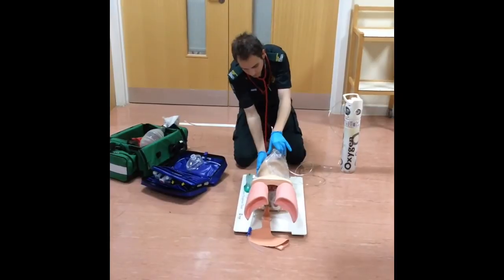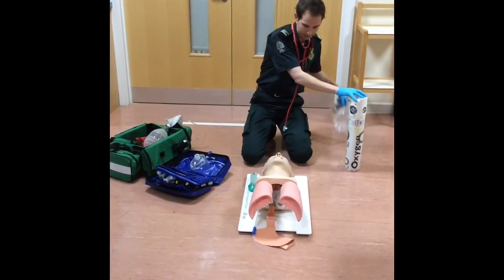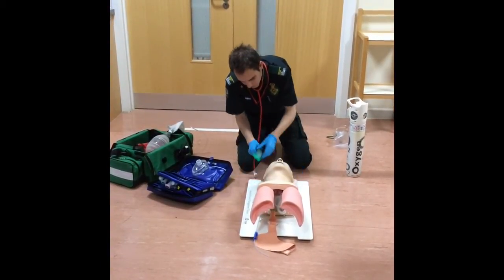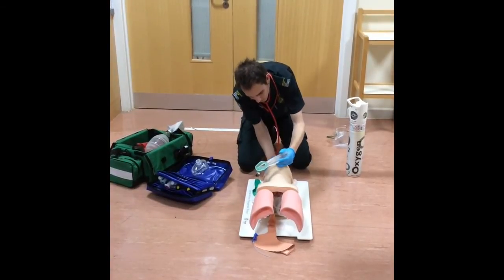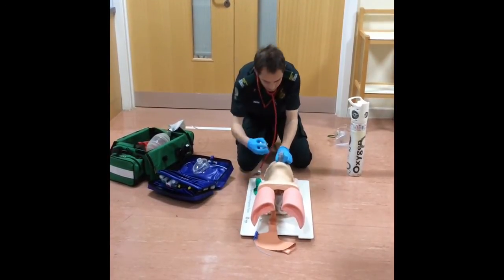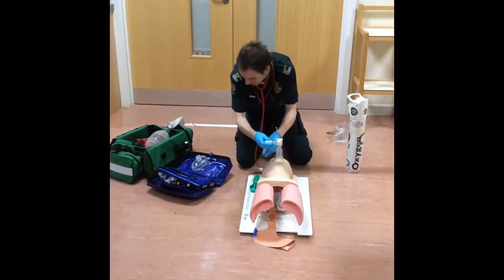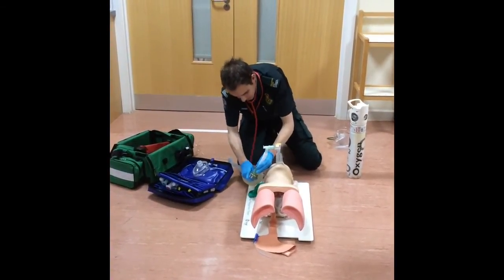Okay, so take the mask off. I'm going to get rid of that now, because I'll connect the bag valve mask up shortly. Take the airway out. Take the i-gel, put the head in the sniffing the morning air position. Just advance the i-gel into the mouth until I feel resistance. Easy cap on top of that, then the catheter mount. Then the bag and mask.